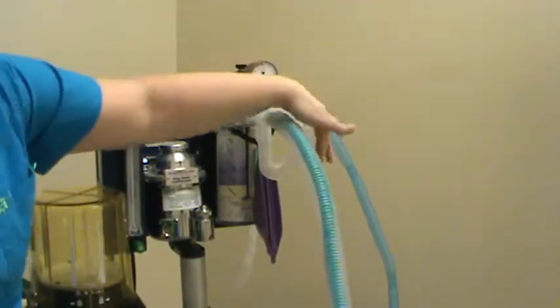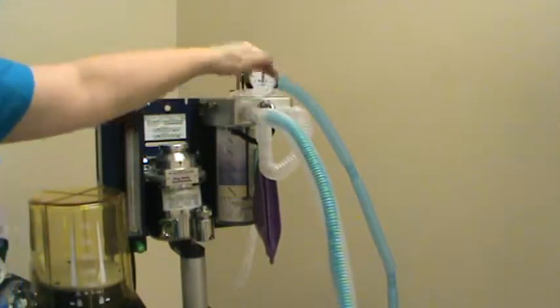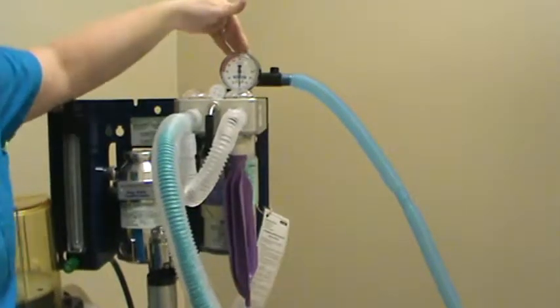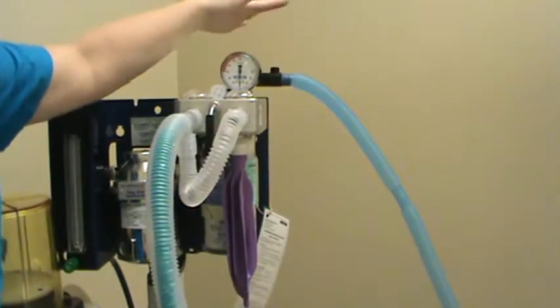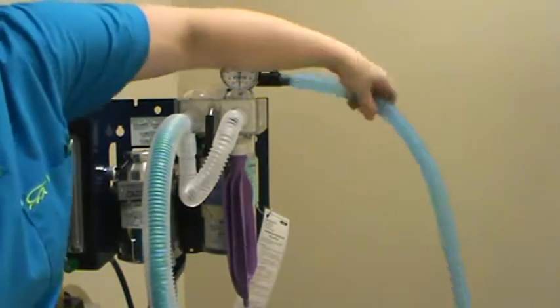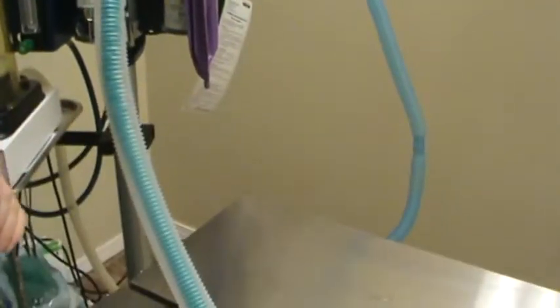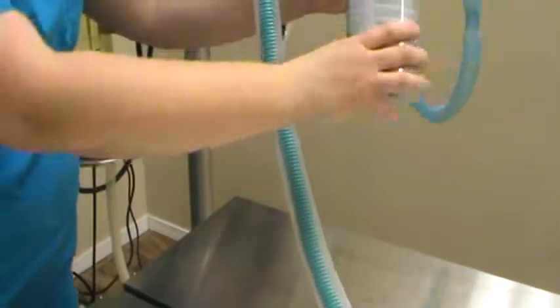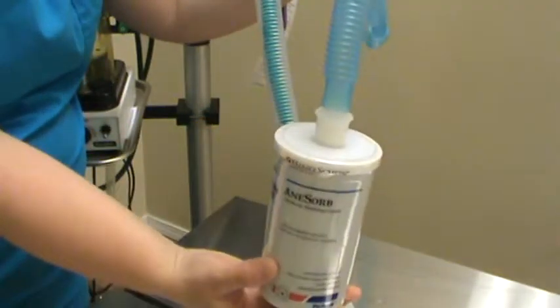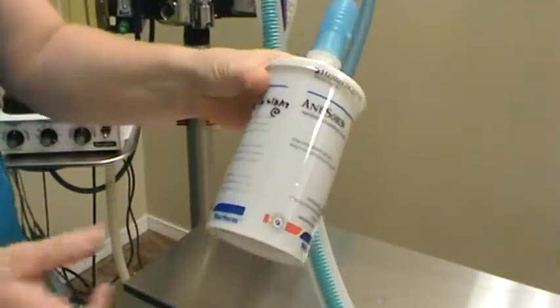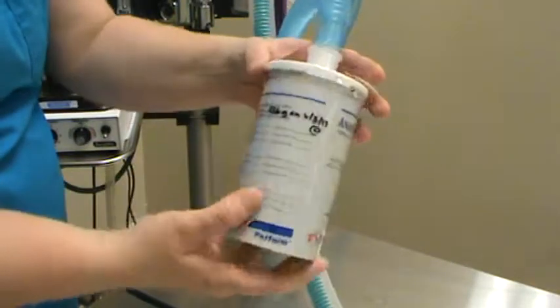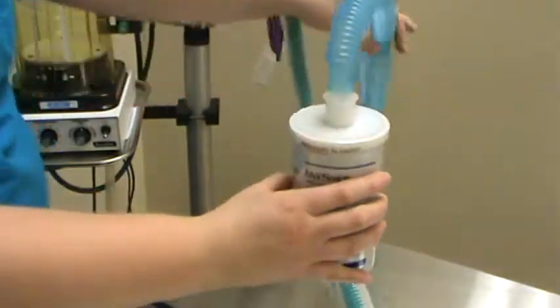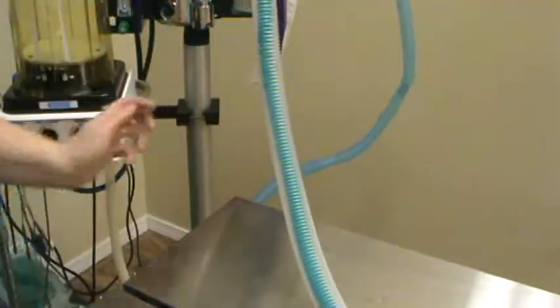Exhaled breaths are going to go out this exhale side and then down through past our pop-off valve, which is right here, and then out our scavenging system. We have a passive scavenging system here. We don't have an active one. It's not going to actually vacuum it out. We change these about once a day, every other day. This is going to collect that waste anesthetic gas.